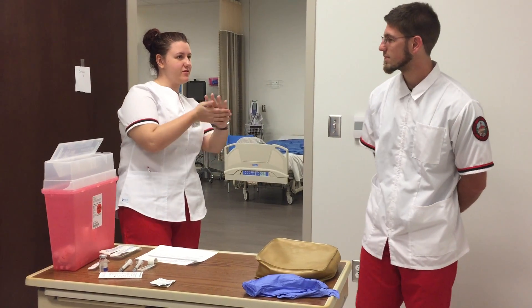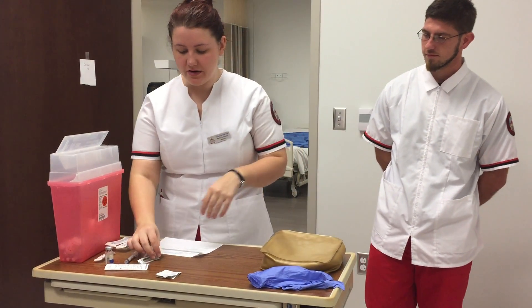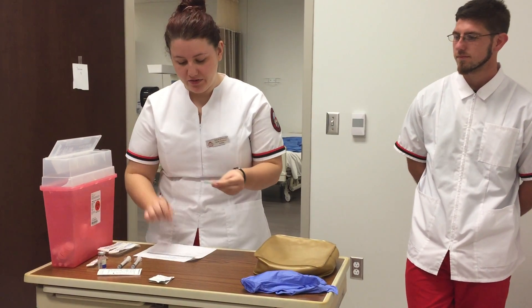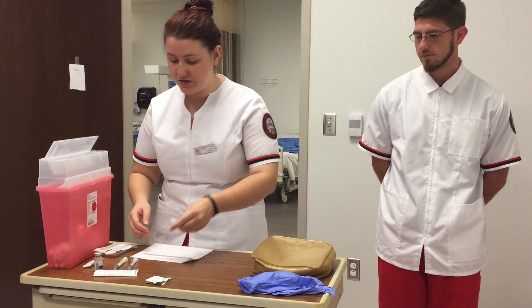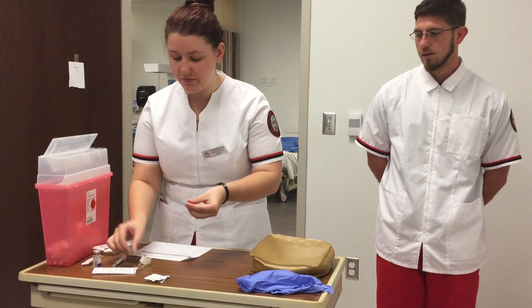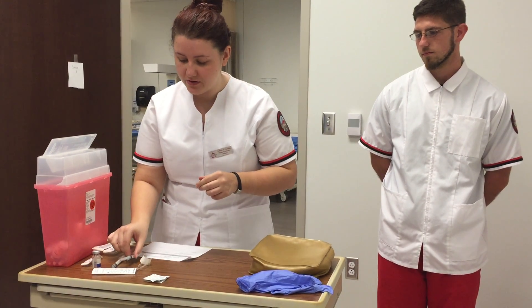Before we get started I'm going to perform hand hygiene. For the intramuscular injection, I'm going to be using a 20 to 23 gauge needle because I have 1.5 milliliters of medication to draw up, and I'm going to use a 1 to 3 milliliter syringe, which is appropriate for IM.